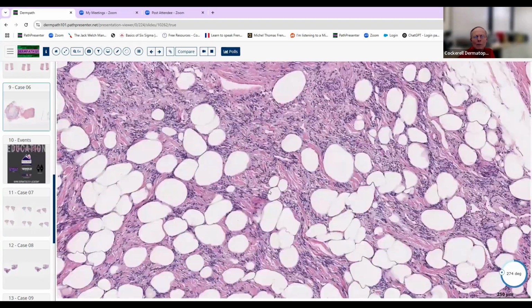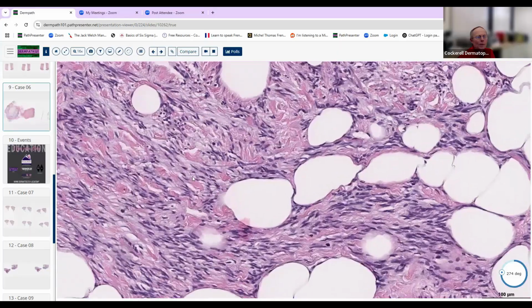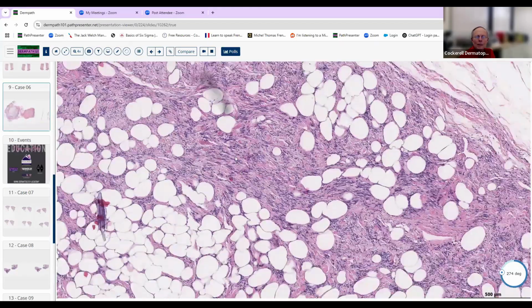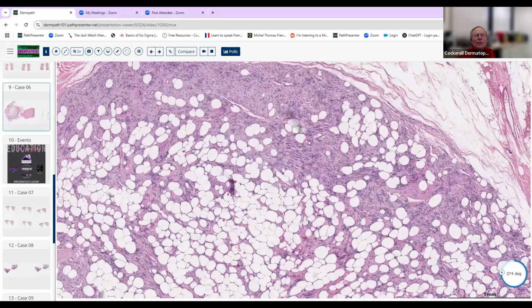So there's fat here, but there's also what looks like this benign spindle cell component that almost looks like some kind of fibrohistiocytic proliferation. If you just saw this at high magnification, I'd say, wow, it kind of looks a bit like a, funny, it's not really a dermatofibroma, but some kind of a fibroma. So probably a hamartomatous fat lesion in which we have both fat and fibrohistiocytic proliferation and collagen stroma. So it's not really a classic fibrolipoma, but it's sort of closer to that.